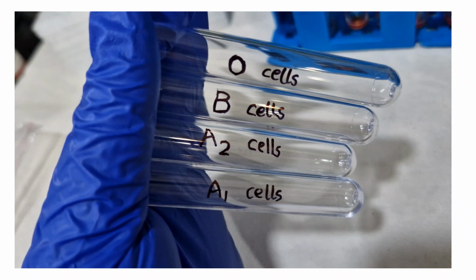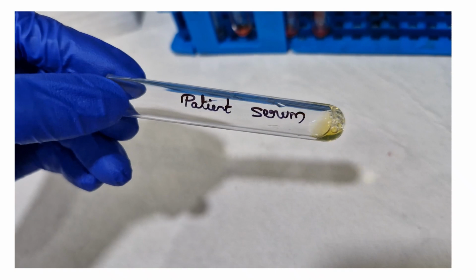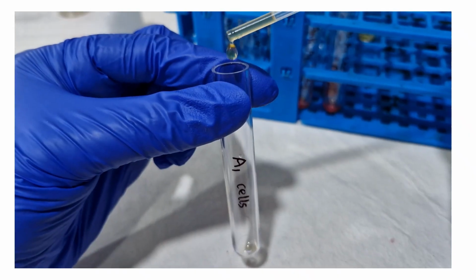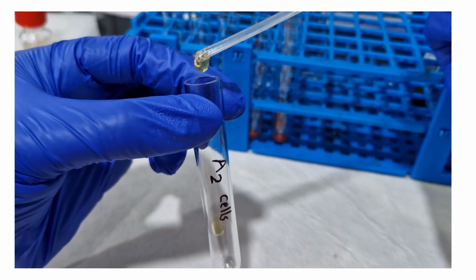Coming to reverse grouping, we will take 4 tubes labeled A1 cells, A2 cells, B cells, and O cells. This is patient serum. We will add 2 drops of patient serum to each tube.